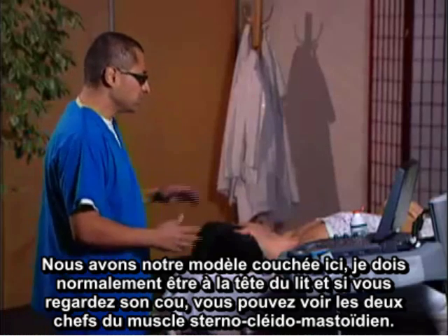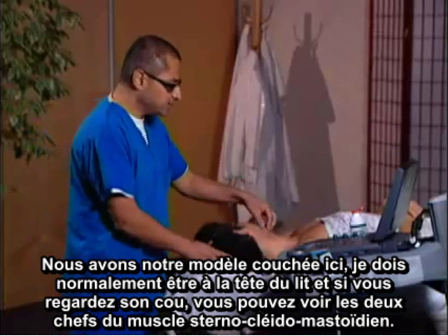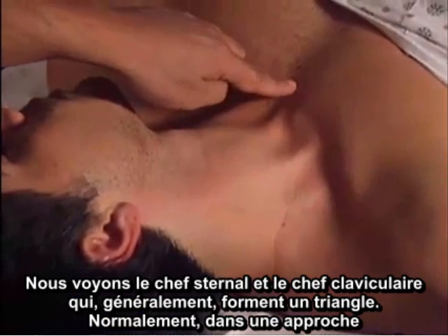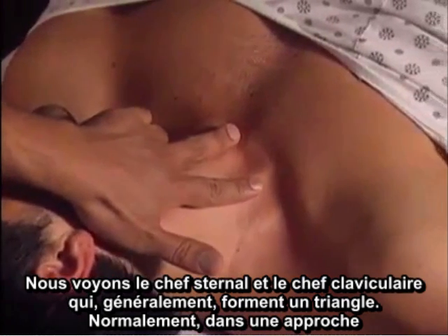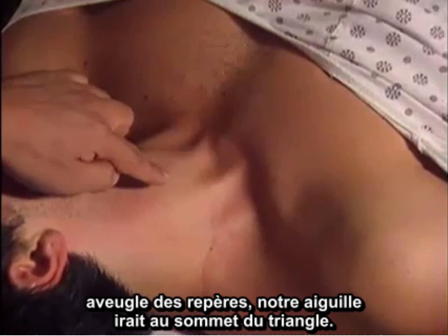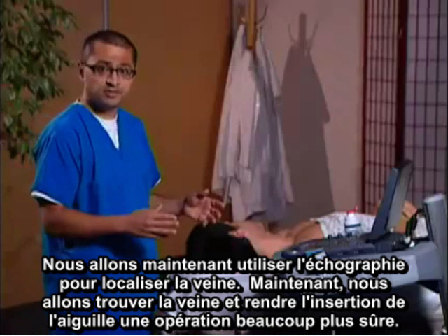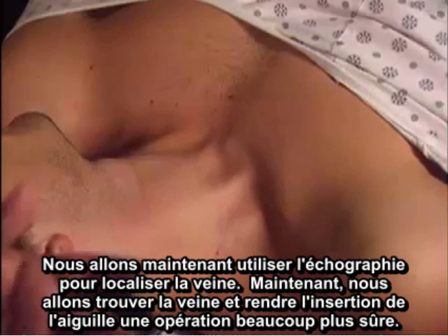So let me show you how we'll position our ultrasound. We have our model here lying down. Normally would be at the head of the bed. And if you look at his neck, you can actually see the two heads of the sternocleidomastoid. We see a sternal head and a clavicular head that usually form a triangle. Normally, in a blind landmark approach, our needle would be going to the apex of the triangle. We're now going to use ultrasound to localize the vein. We're going to now find the vein and make the needle insertion so much safer.